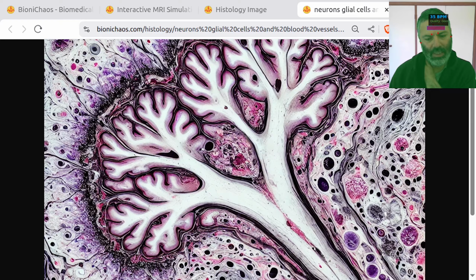Okay, I'm particularly interested in not the preparation, but the actual data processing after we have the image. After imaging, histopathology data processing includes digitizing the images, applying algorithms for tissue segmentation, quantifying features like cell density or morphology, and using statistical models for diagnosis or prognosis. Web simulation tools can assist in visualizing these computational steps.